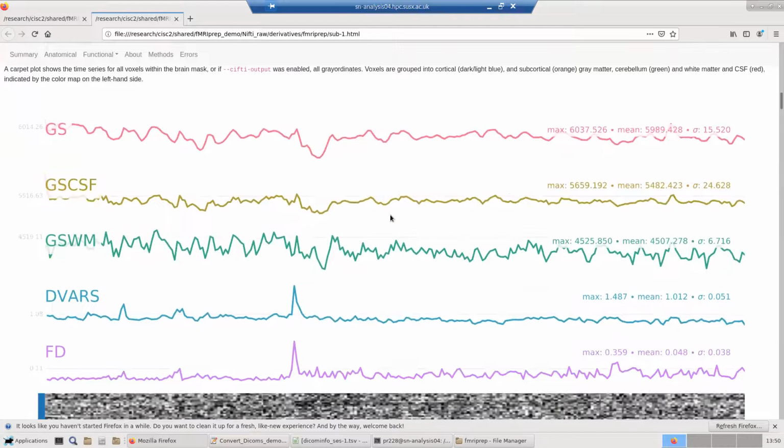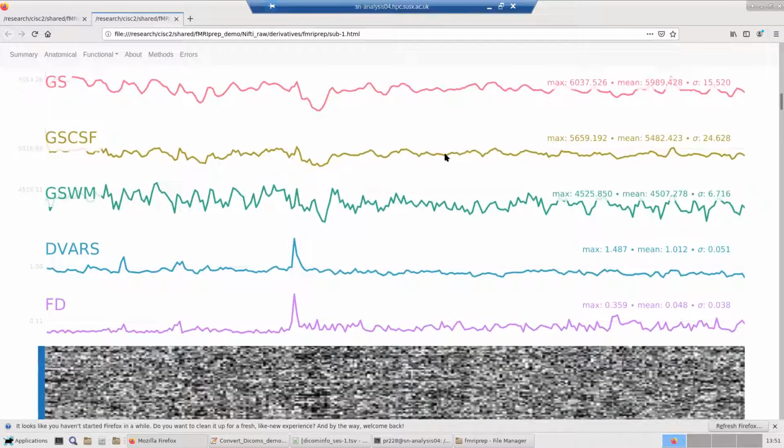If you do functional connectivity, you have the global signal. So if you want to do a global signal regression, that's quite easy. It's not the case that with some preprocessing pipelines, you run it, you have the normalized images, but then you don't have the frame-wise displacement, and now you have to do the motion correction specifically to get the frame-wise displacements or something like that. Basically, it does store quite a lot of this information in an Excel sheet, so you can use it if you want to.